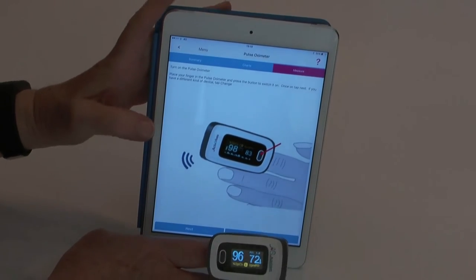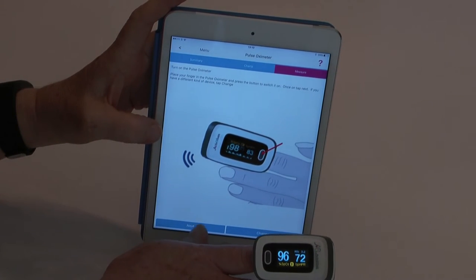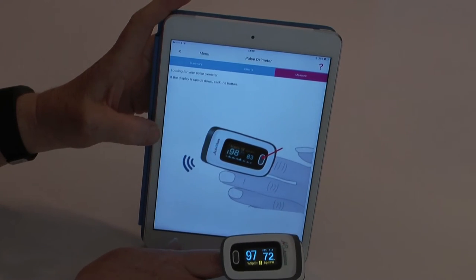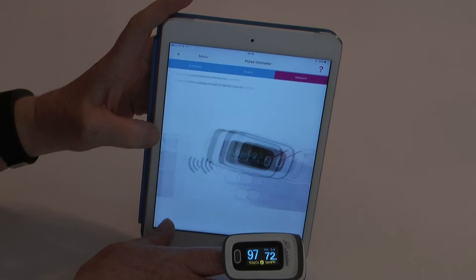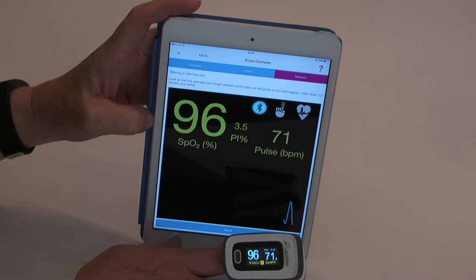On the upload page, press the pulse oximeter 2. It will search for the pulse oximeter and then connect and start to show the perfusion index reading, which is the small number in the middle of the screen.